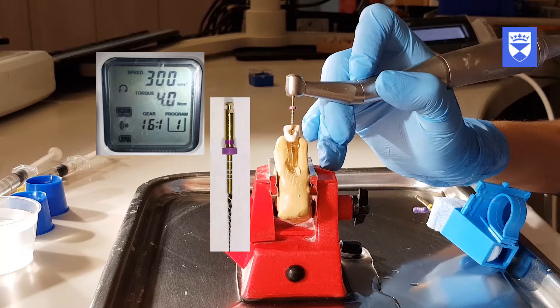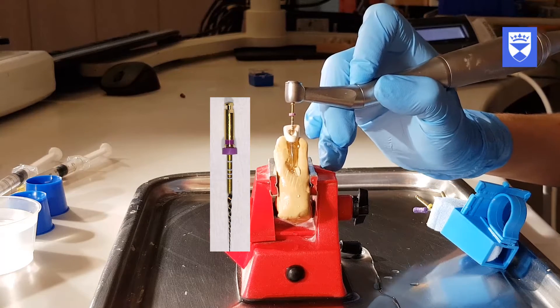Starting with the S1 file, the file should be used up to the working length with follow and brush motions.